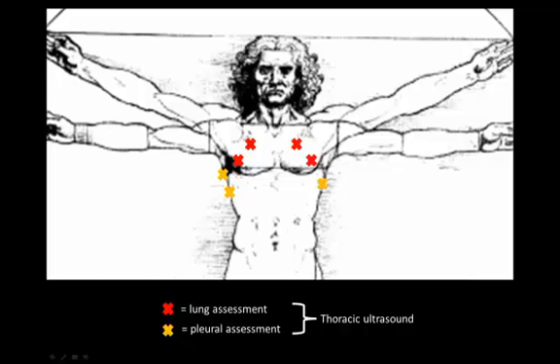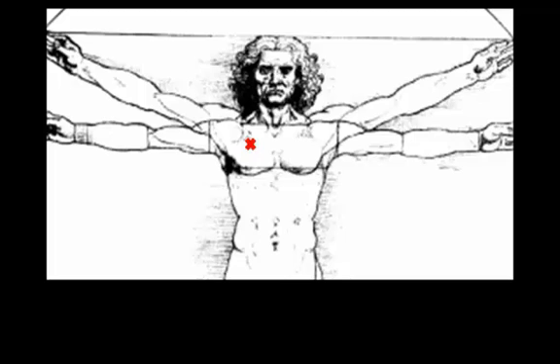Of course, you would continue on and do this on the left side of the patient as well, and that would represent a complete thoracic ultrasound. So let's review these views one by one. The first was the anterior chest wall view, in this case the right anterior chest wall, or RACW. We must label our views on the machine, because lung ultrasound views often don't possess any lateralizing anatomy that tells you what side of the patient is being examined.